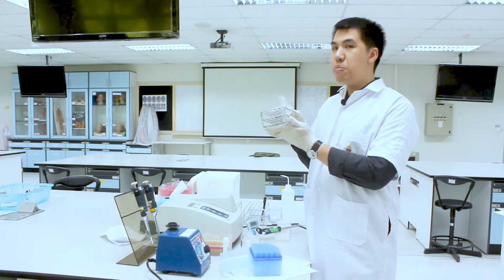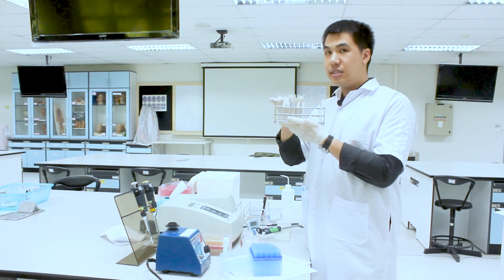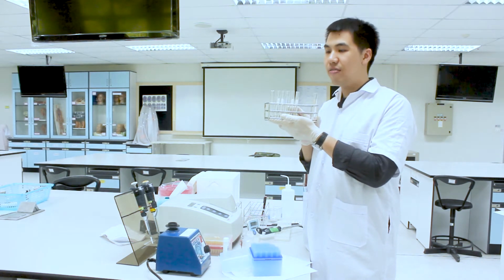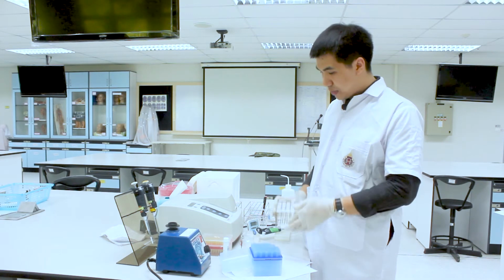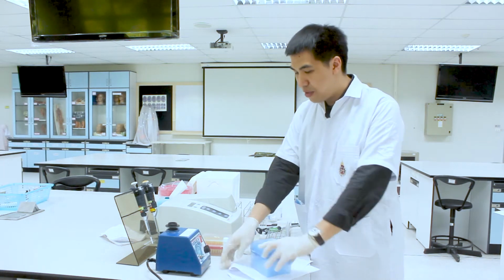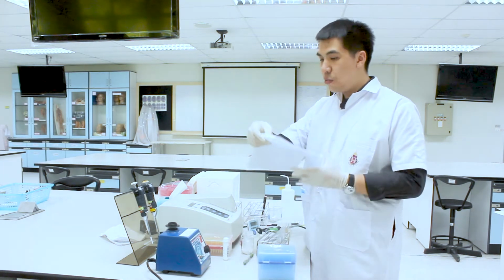For me, I have already prepared the 6 test tubes and added the cholesterol oxidase reagent. Now I'm going to add the samples into these 6 test tubes. From the menu, in tube 1 you add the blank solution. The second you add normal control.